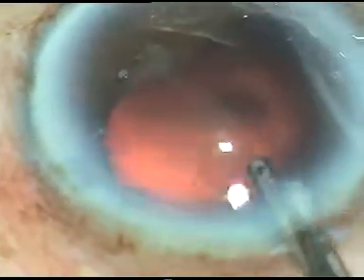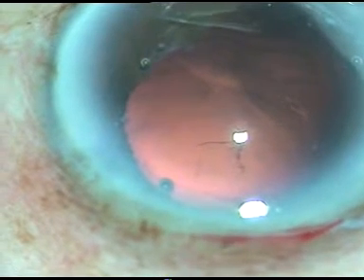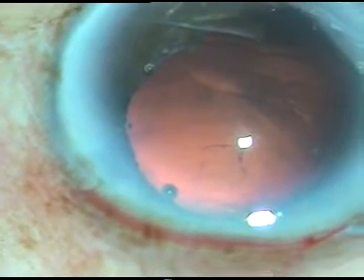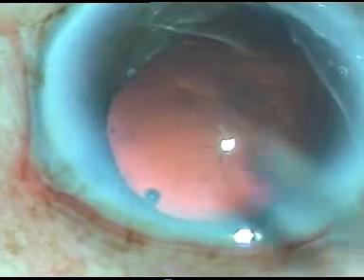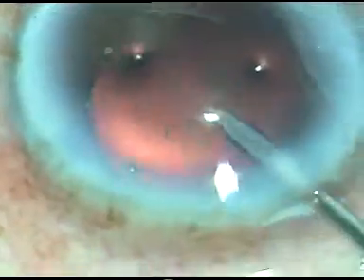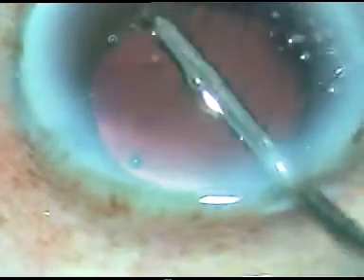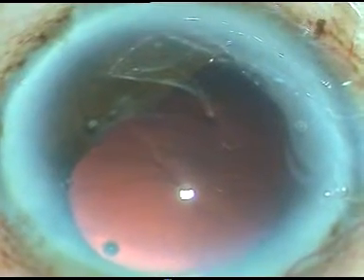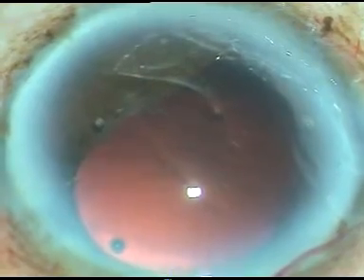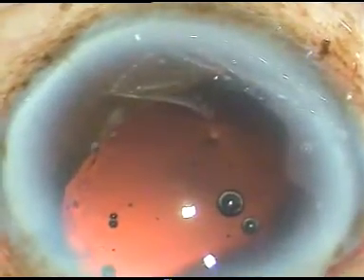Now I am going to implant a hydrophilic acrylic intraocular lens in this case. My plan is to trim the iris tag where the margin got caught into the aspirating port of the phaco handpiece. I have used irrigation to polish the posterior capsule. Now viscoelastic substance, HPMC, is being injected, and a hydrophilic acrylic intraocular lens is being implanted.